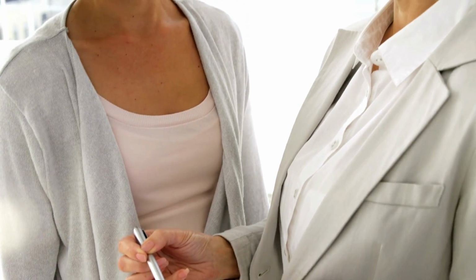So if we're going to do neurofeedback, one, it seems like you're a good candidate. Two, we're going to be training this down to reduce those symptoms, and you should notice a difference within, say, 5 sessions. Not a huge difference, but maybe like 10% towards your goal, a little bit there. If you're not noticing a difference within a few sessions, then you might want to adjust and try a different protocol. Because there are different protocols, they're used at different times. There's monopolar, bipolar, I talked about that in another video.